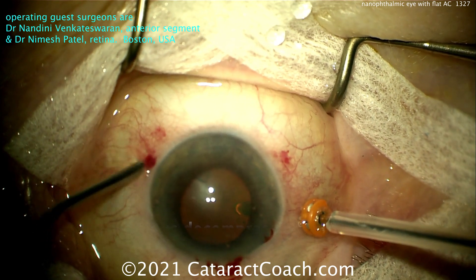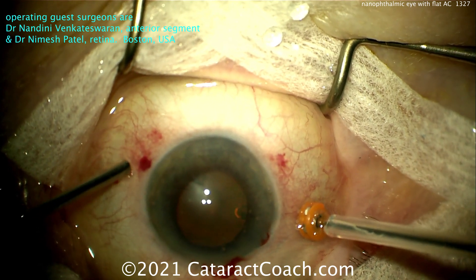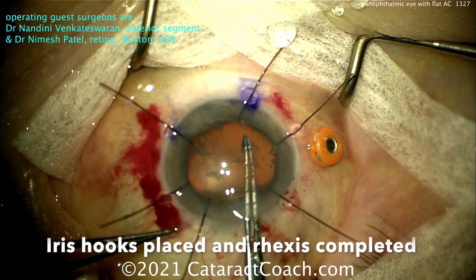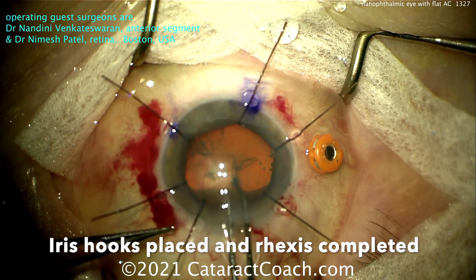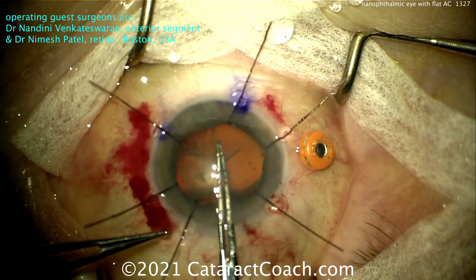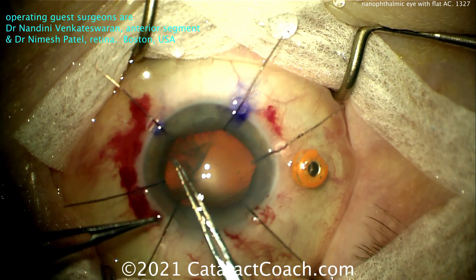Again, be very cautious. I love the fact that we've got our cataract surgeon and our retina surgeon working together on this same case. Iris hooks going in — I like that idea too. This is a tiny little eye. Measure out that capsulorrhexis. I like your forceps, by the way, with all those marks on them so we can judge the size.